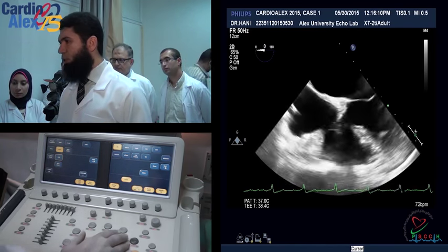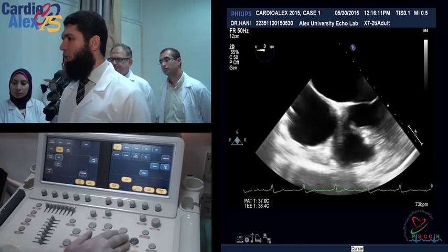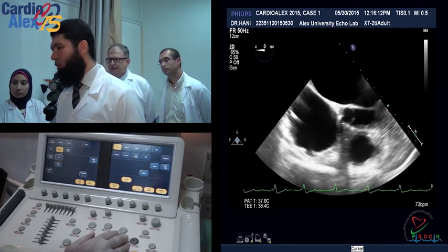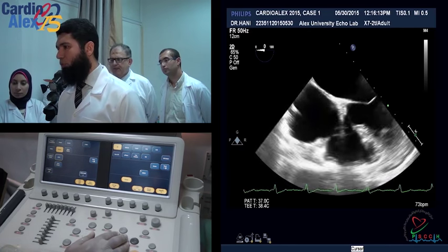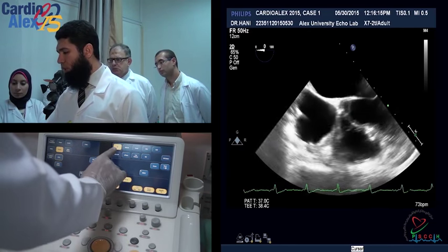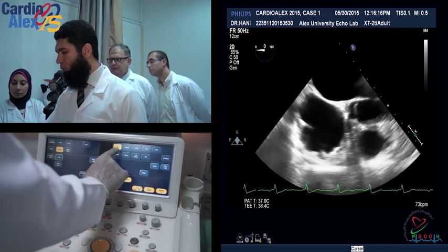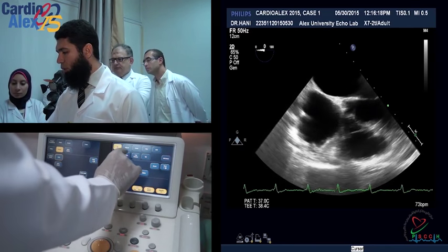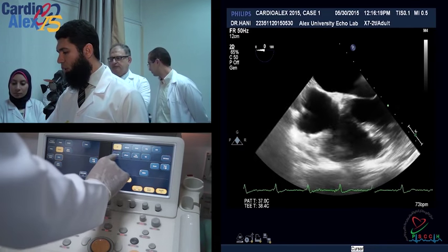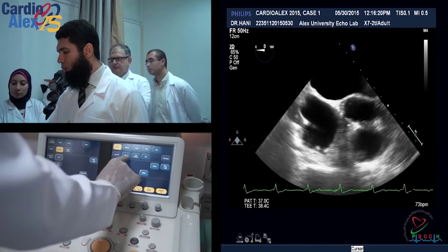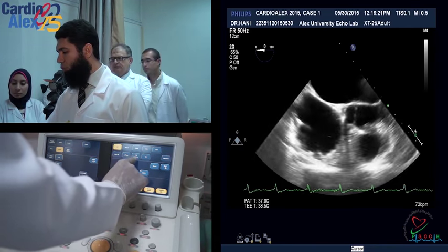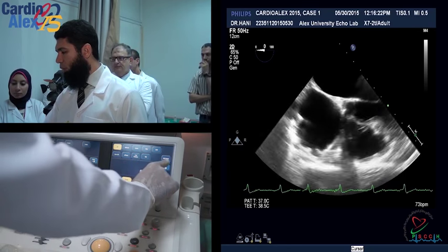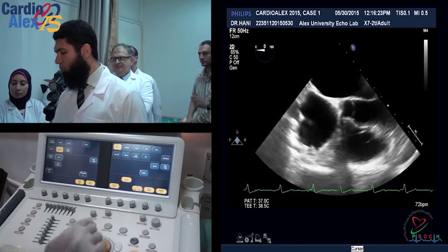Then we'll go through each cardiac structure — like valves, the septum, or left atrial appendage — and how to assess it by 3D TEE. The first step is the acquisition modes and image control. As we can see from the keyboard, we have 2D, Live 3D, X-Plane, Full Volume, and 3D Zoom.